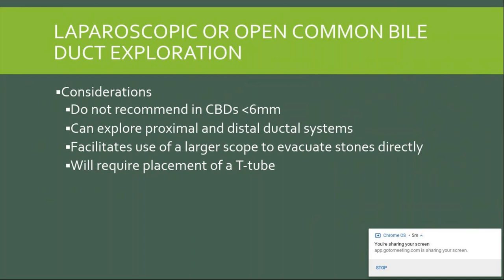So something you might jump to a common bile duct exploration for is if you saw a larger stone that you knew you weren't going to be able to get out through the cystic duct. And then the last thing is it will require placement of a T-tube after the fact. So you should familiarize yourself with that equipment. And then I would also leave a drain.